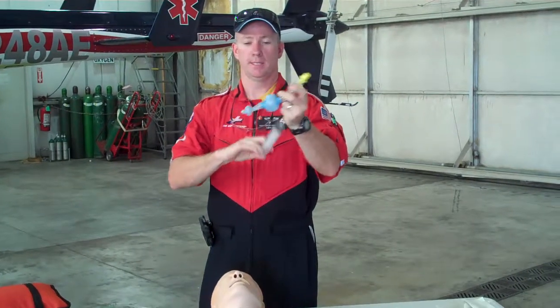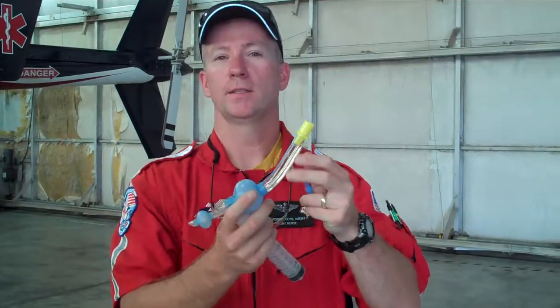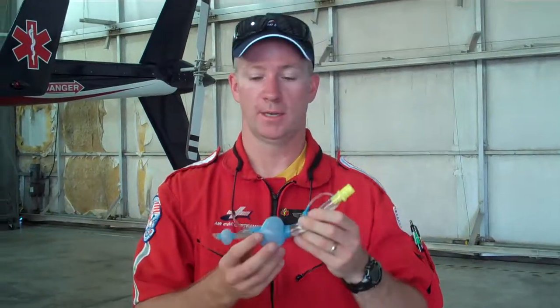So this is basically placed inside the patient's esophagus. This is placed inside the patient's mouth. You can see that's quite damaging to the mucosal membranes and can be quite uncomfortable. These are not kept in the patient for long. This is basically placed in the street or on a rapid response call where a doctor can't get somebody intubated due to the patient's morphology or pathophysiology. Big tumor in the neck, and you just can't see those vocal cords to get the tube through.